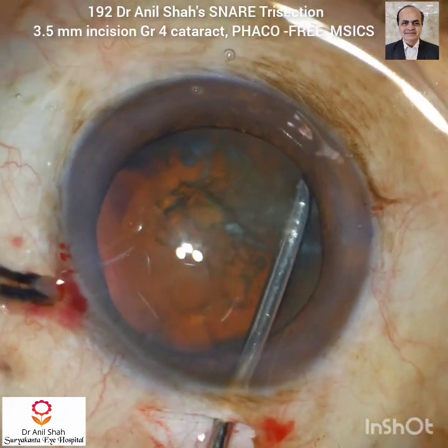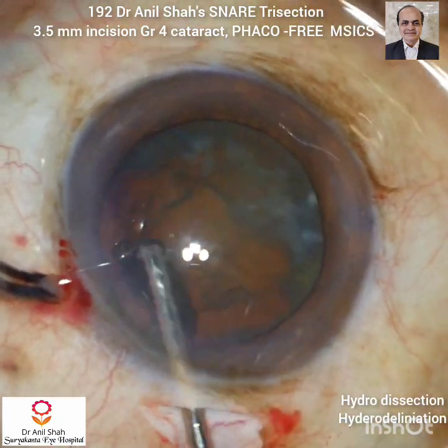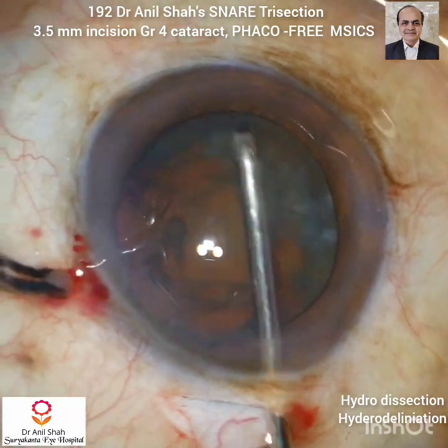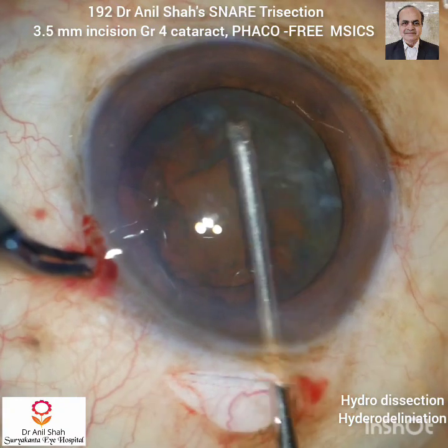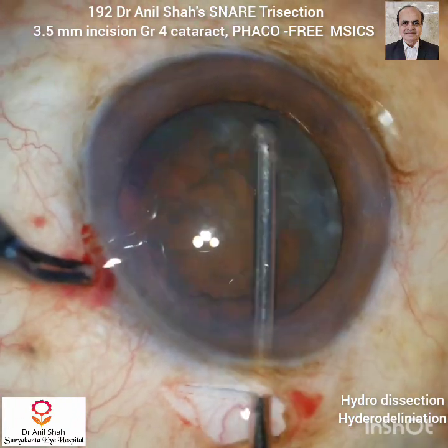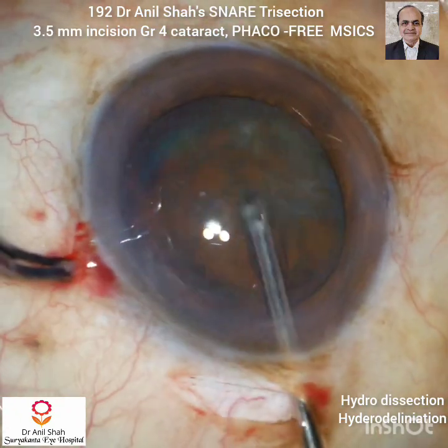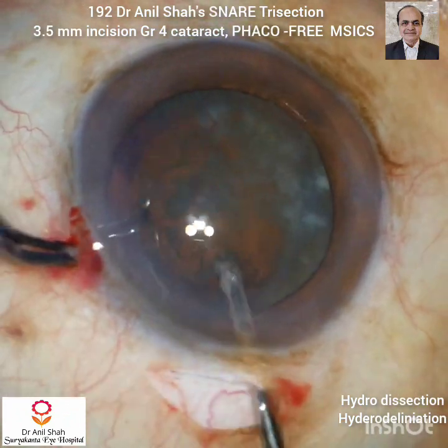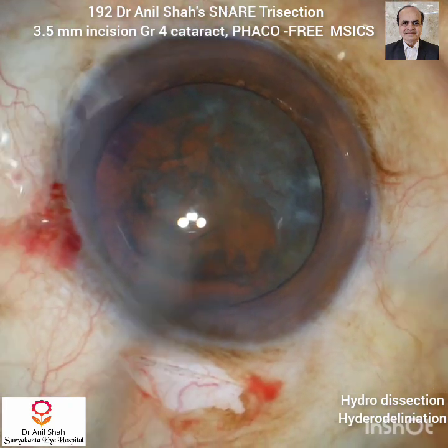Now this is my special 22 gauge cannula with the tip facing downward, connected to a BSS bottle. I use this cannula for hydrodissection and hydrodelineation, also for rotation of the nucleus. I try to remove as much of the epinucleus from the surface of the nucleus as possible and delineate the core embryonic nucleus.